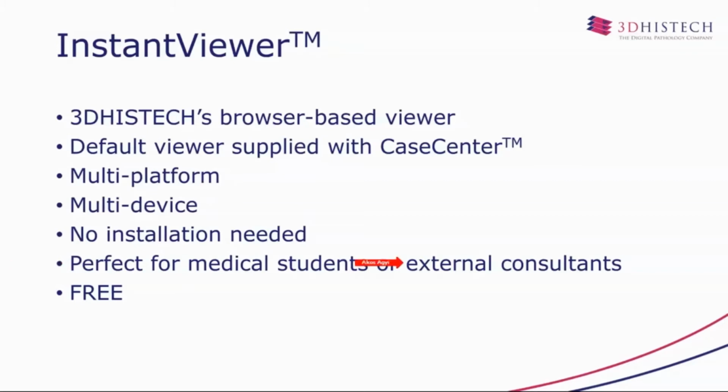If you share a digital slide with a colleague from outside your institution, probably that person, even if he is willing to install our CaseViewer software, is not able to do it because of strict IT regulations. So in that case, it's also handy to be able to open the digital slide directly from the server inside the browser without any additional software. And of course, this viewer is also free of charge to use.